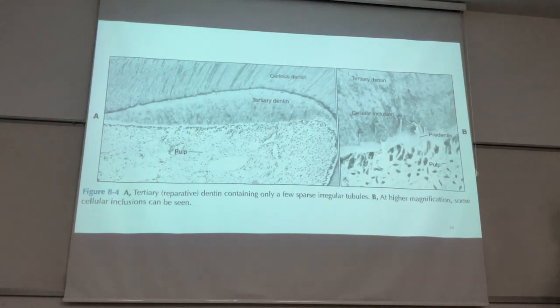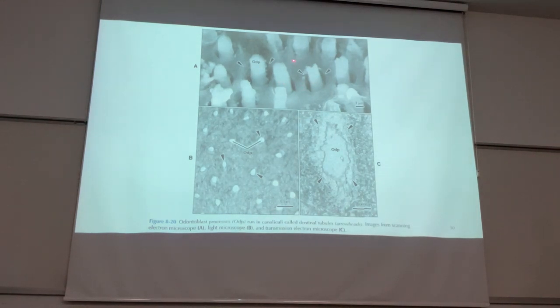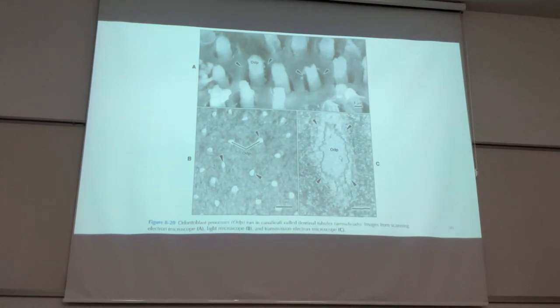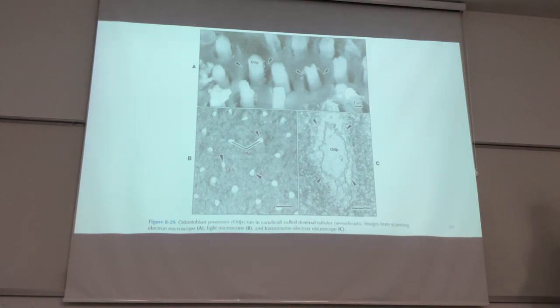Okay. Again, you can see that this is our tertiary dentin structure. Look at here. Now you can understand the structures of odontoblastic process present between the dentins. This dentin is our peritubular dentin, and this dentin present between them is our intertubular dentin. What is the name of this area? Space. Periodontoblastic space. Okay. Periodontoblastic space.